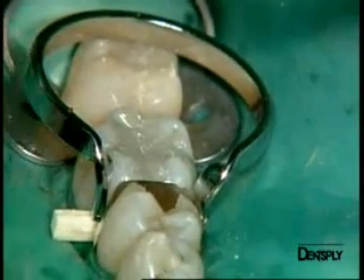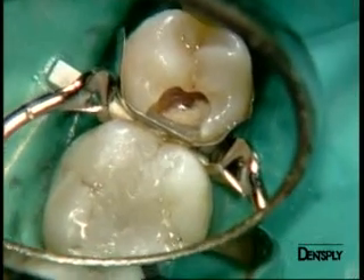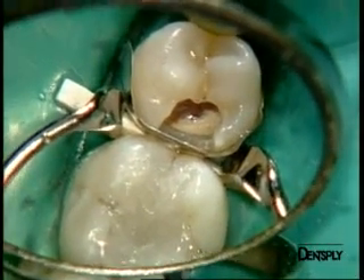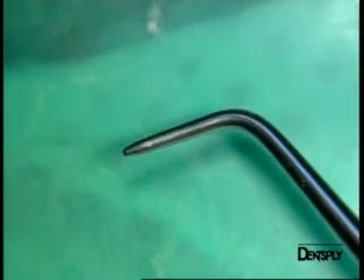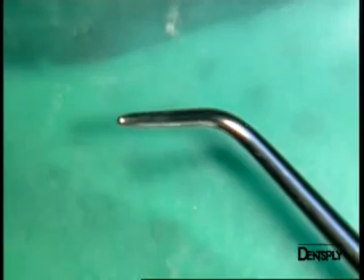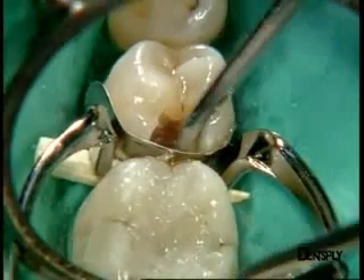We place a paladin separation ring to improve the quality of the contact points, as it will create the space needed for better proximal contact between the premolar and the first molar. The matrix is adapted with a burnisher, giving the matrix the desired shape. The cavity is now ready to be filled.